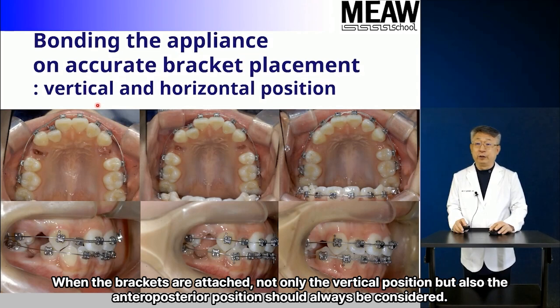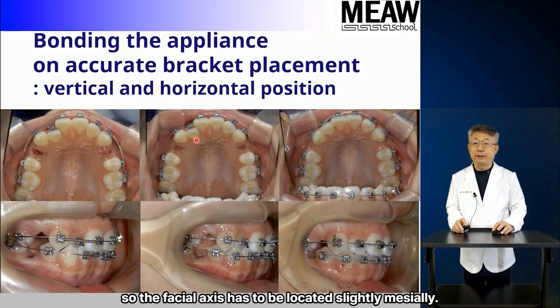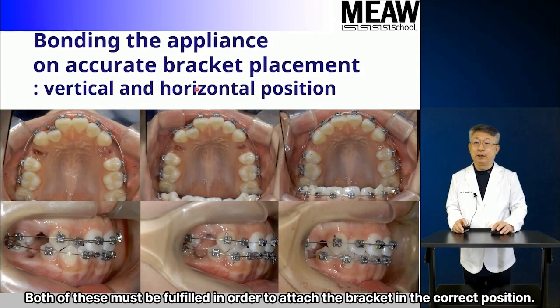When the brackets are attached, not only the vertical position but also the anteroposterior position should always be considered. Most of the palatally displaced teeth are mesially rotated, so the facial axis has to be located slightly mesially. Both of these must be fulfilled in order to attach the bracket in the correct position.